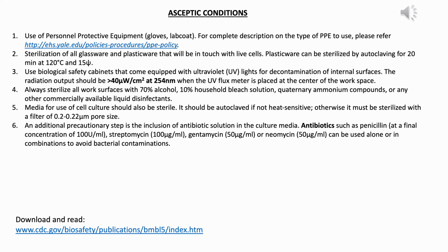Another source of contamination is the cell culture media. The media should always be sterile. If you are making your own media, then one has to autoclave it, and if any of the media components are heat sensitive, then you can filter sterilize it. The pore size for the filter should be around 0.2 microns, so anything less than 0.22 microns. An alternative method is to buy commercial media, which has all the components already added. Those are packaged sterile, and they remain sterile as long as you open them under the biosafety cabinet.